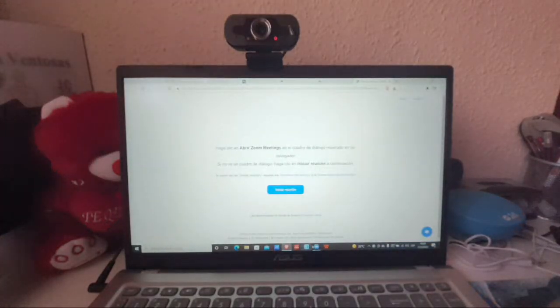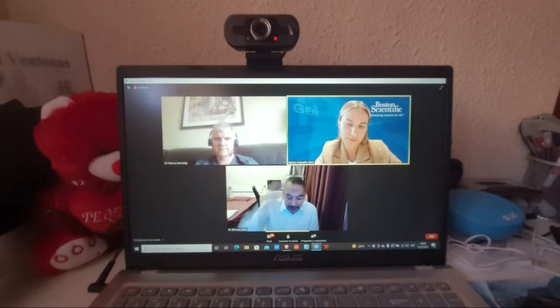I don't think it's needed for critical patients. It's less practical, I would say. For the elective intubation, it has its established role. But practically speaking, if you have a sick patient on the medical floor or the surgical floor or in the ED, the preparation time for awake fiber optic intubation adds to the challenging situation. It has its role, yes. If the patient already has a tracheostomy, and I'm sure Marcus would agree with that. The fiber optic has a place in airway management, but not for the intubation process itself.